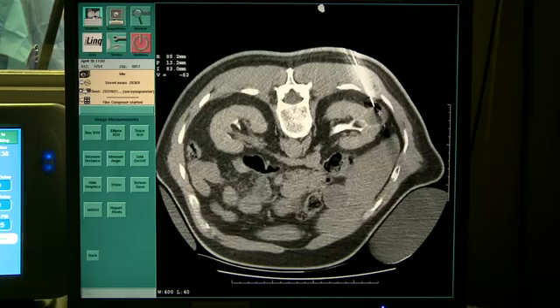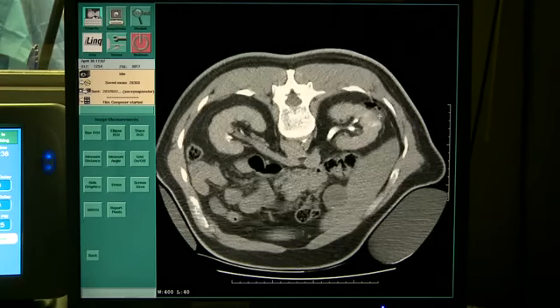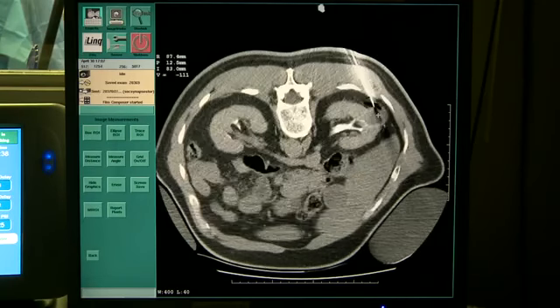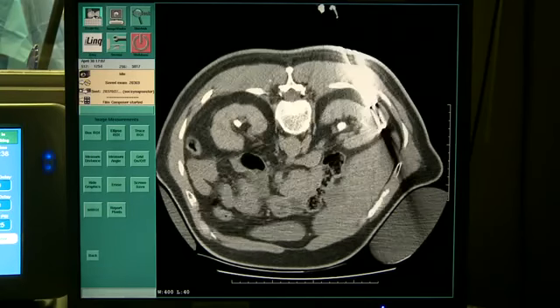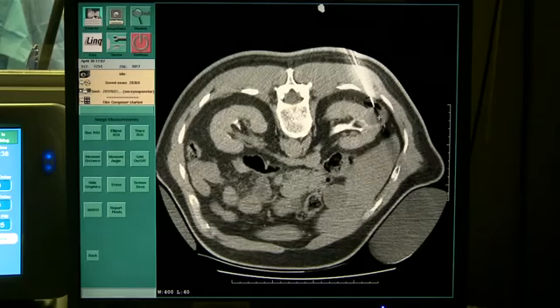And as we continue down towards the bottom of this lesion, again, we go from probe to lesion to almost no lesion. I think that if we just froze these, we would be successful. But again, I'll heed my own advice. You know, this is cancer, and it's just one more probe. It's a little bit more time, but we really do want to do the best thing for this guy and make sure we get this medial lesion. So I'm going to put a probe right through here.